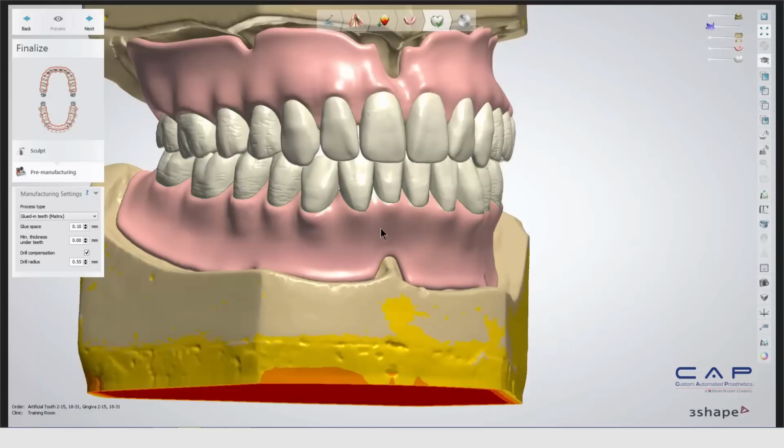But it doesn't take care of the tooth setup and the acrylic. No. Yeah, those have to be done separately. I think at some point there'll be things we can do digitally to do the setup on partials, and then probably have a different workaround to get the acrylic in. The difficulty with a partial is that we have to get the acrylic to flow through all of the undercuts made in the partial to hold the acrylic to the chrome cobalt.